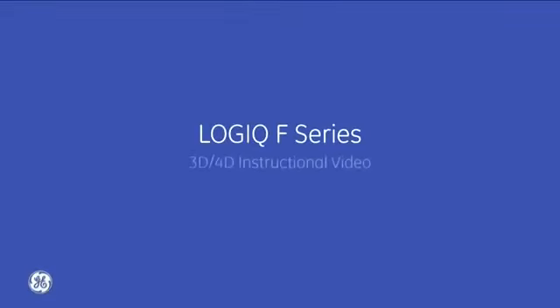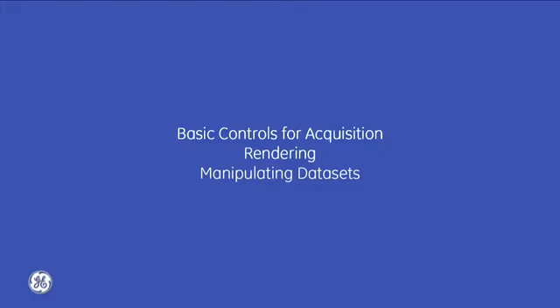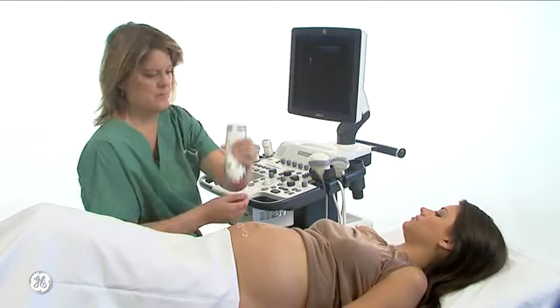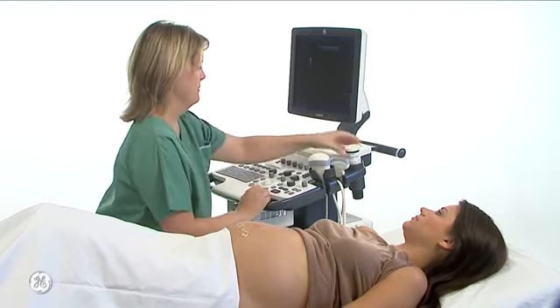Welcome to the Logiq F series without touch panel 3D 4D instructional video. I will now go over the 3D 4D capabilities of the Logiq F system, including the basic controls for acquisition, rendering, and manipulating datasets. Let's begin with what's required to perform 3D 4D image acquisition.